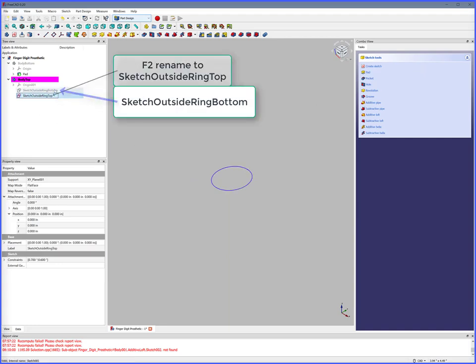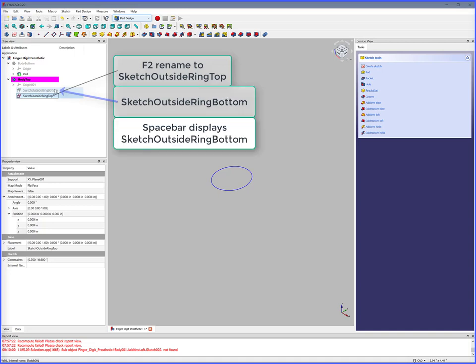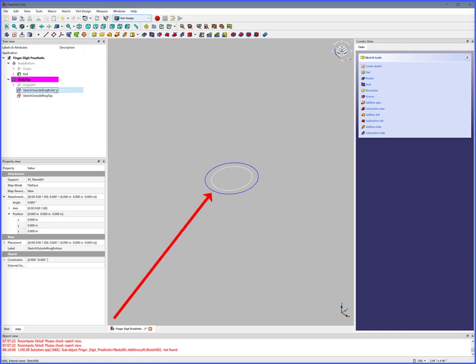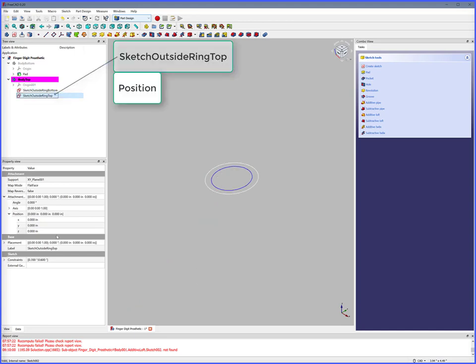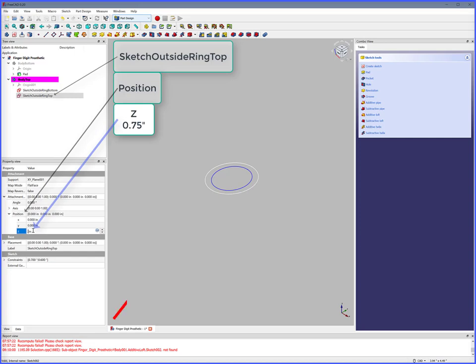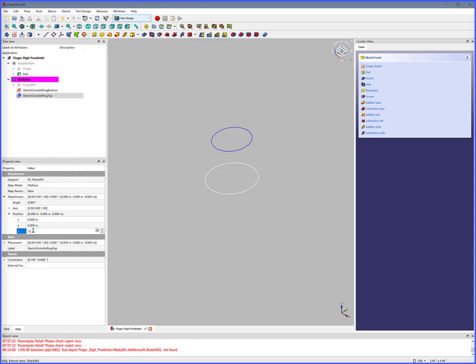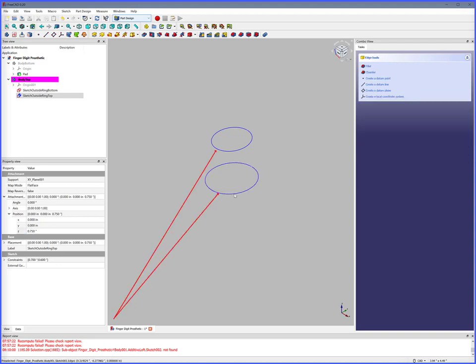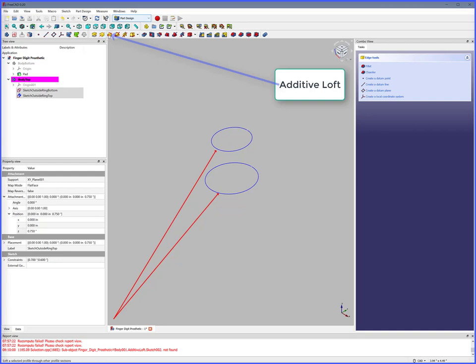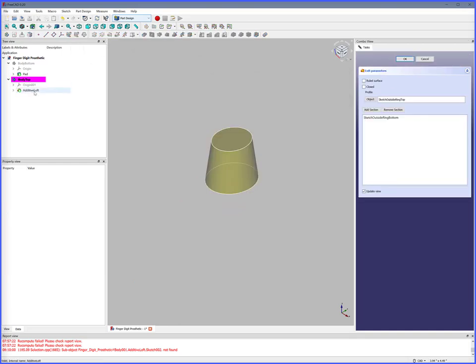Select Sketch Outside Ring Bottom, spacebar to display it. Select Sketch Outside Ring Top, Position — Z equals 0.75 inches. Click both sketches while holding the Control button, then Additive Loft. We now have a sloped cylinder.